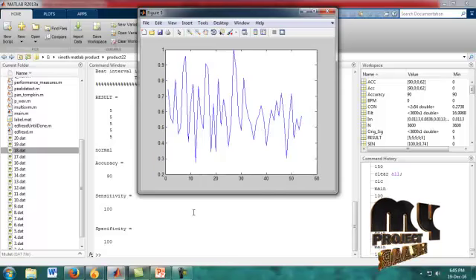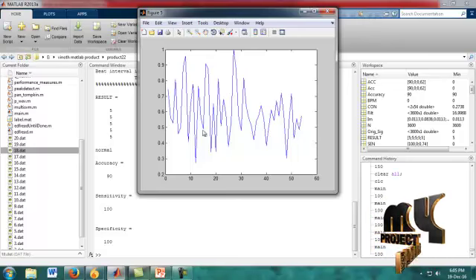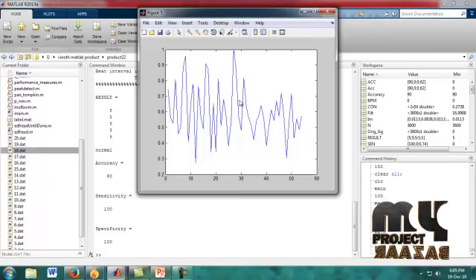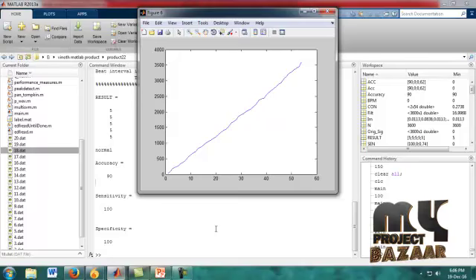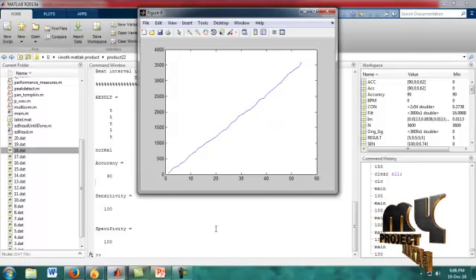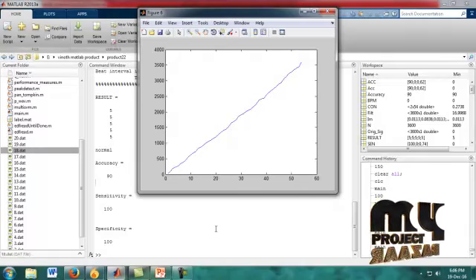Figure 5 shows the peak detection of our input signal. In that input signal, it is the P wave detection. Figure 6 shows the maximum beat rate of our ECG signal. It is our maximum heartbeat rate.